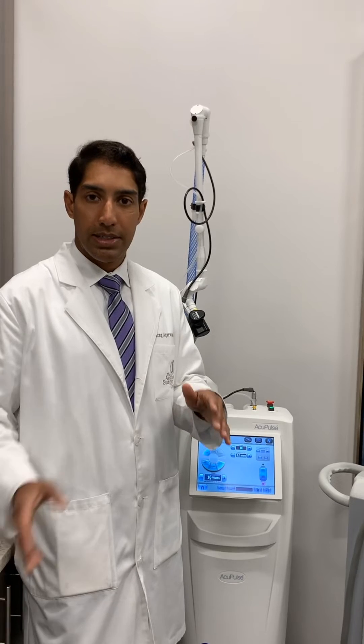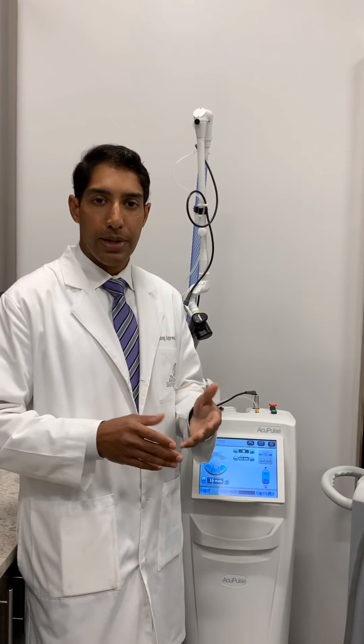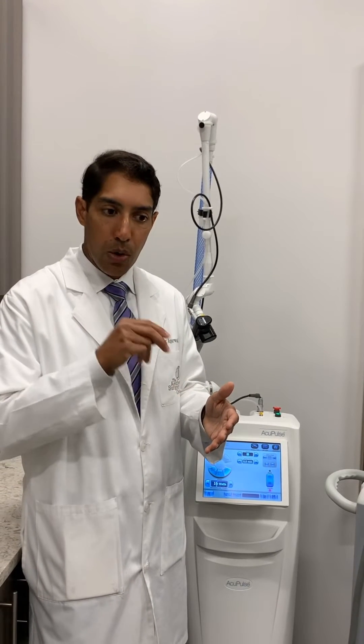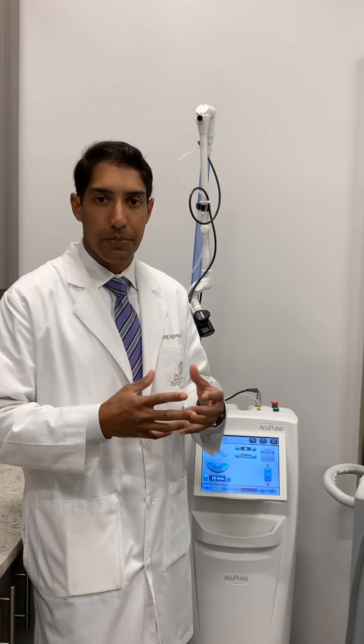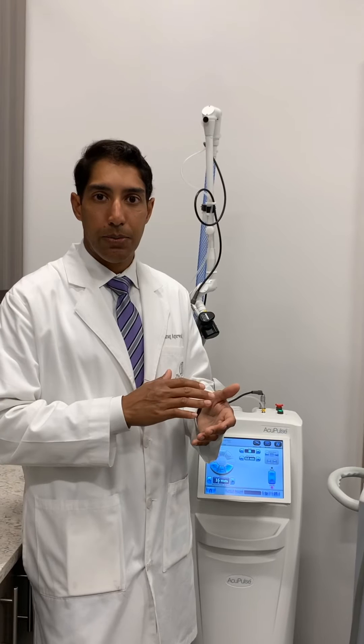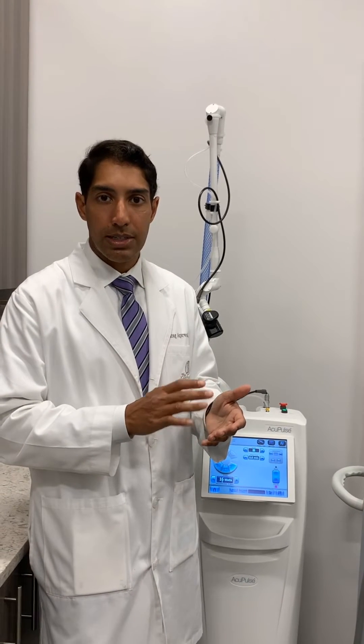Fractional is a step down from fully ablative. It's probably our workhorse laser where we can preserve some intact skin between drilling small holes in the skin to deliver heat and cause tissue tightening. The fully ablative laser is really used for those people who have very deep wrinkles and need a total resurfacing, and it's only suited for certain skin types.